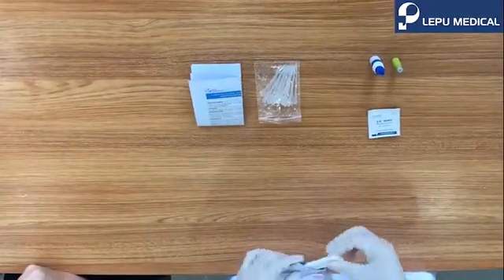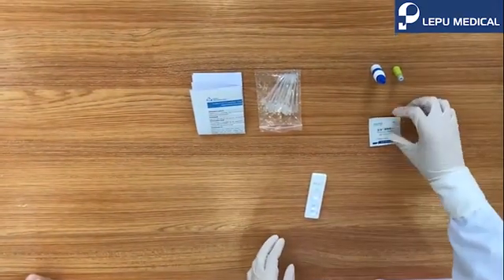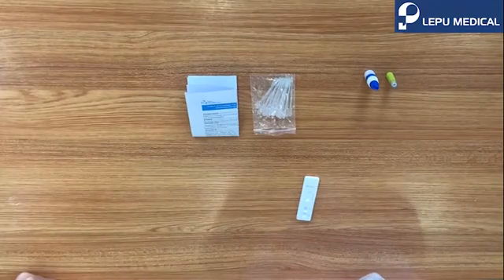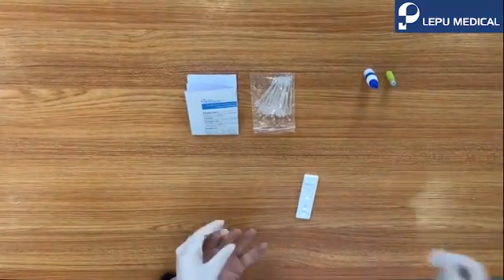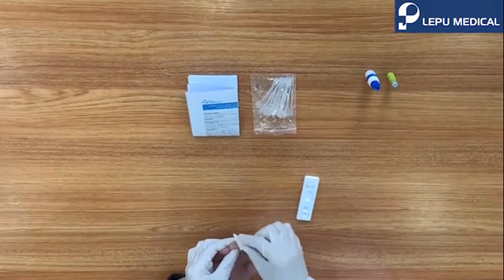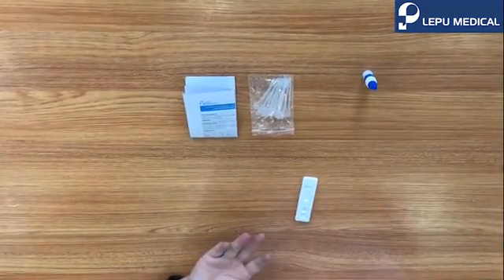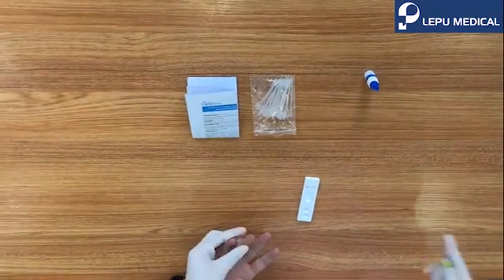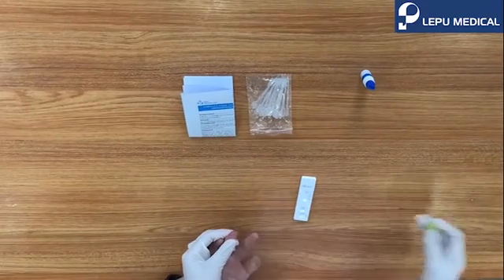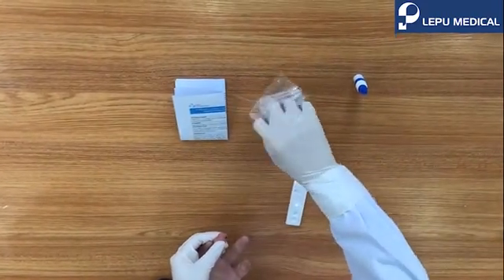Open the pouch, take the card from the pouch, and lay it down on the table. Use the alcohol swab to clean the finger. Massage the finger smoothly. Uncover the lancet, attach the needle side to the finger, and press to the end.